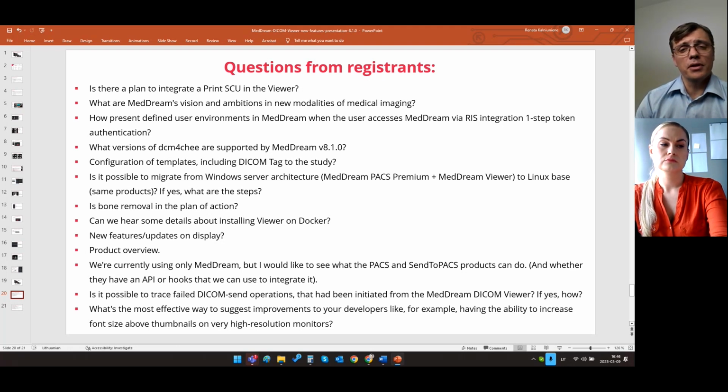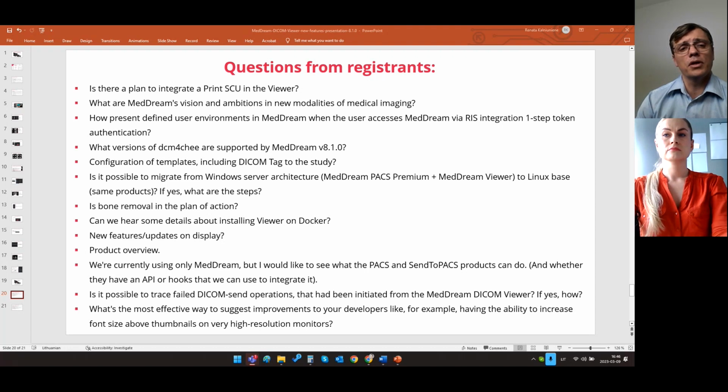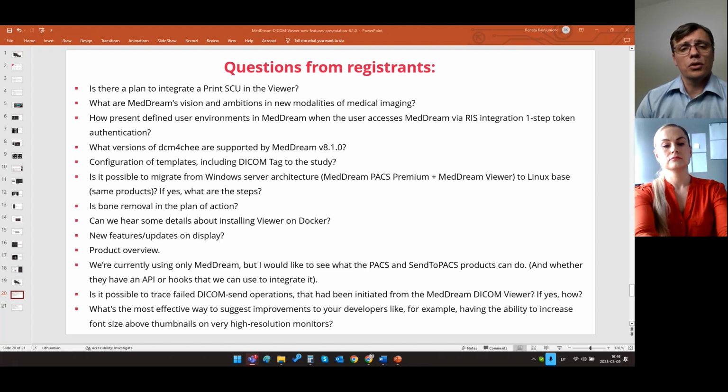So this is definitely a field of our most development, to support more and more different types of devices. Also this year will probably be a turning year for dentists. We hope that this year we will complete all dentist needs, and dentists will be fully covered with our viewing technology. As I already explained, from the next version we will cover 100% of orthopedist needs. Ophthalmology is also already covered. So our viewer must be the widest viewer around the world.